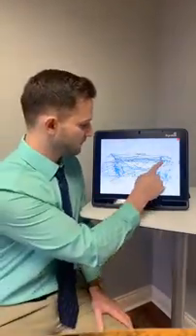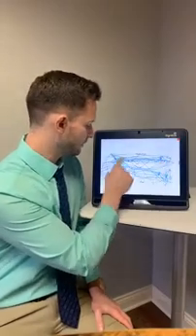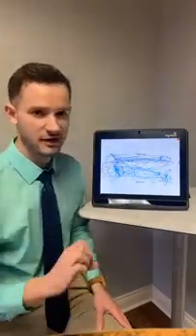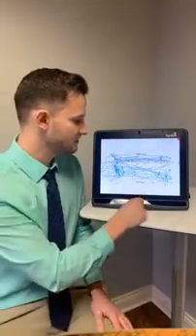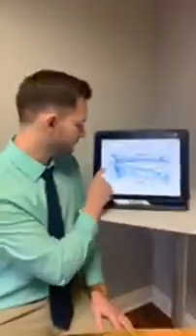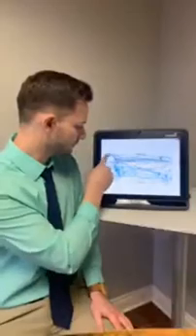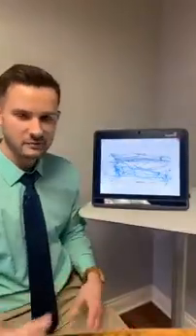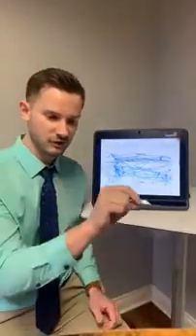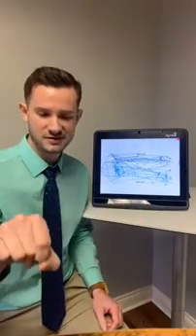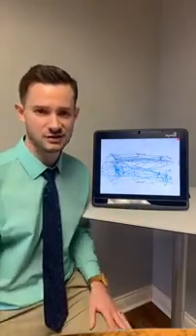If you can tell there's little bullseyes here and here where the right eye and left eye showing how accurate they are hitting those targets, you can see that there's a lot of inaccuracy, especially over here. So that patient has a hard time when they're looking at a word, finding the next word and pointing their eyes accurately to that word is a challenge for this patient.